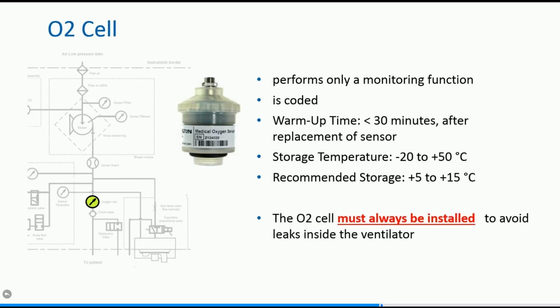The O2 cell performs a monitoring function only. Note that the O2 cell is not required to control the O2 proportional valve and the FiO2 mixture. You might remember having seen that when we made the sample calculation of the QO2. The O2 cell is coded. To guarantee the correct functionality, the device will only accept O2 cells from Hamilton Medical.